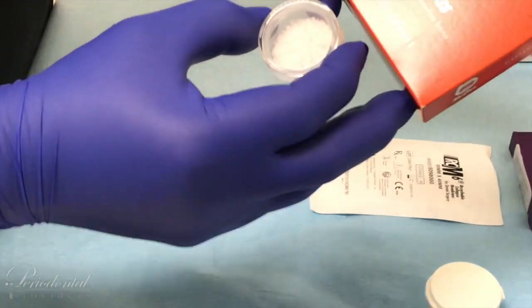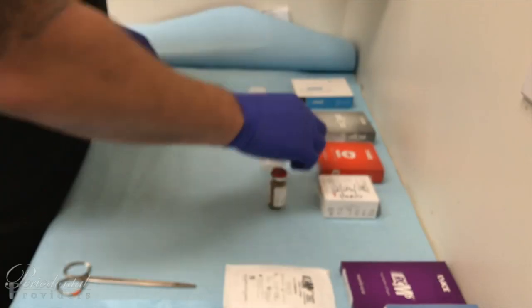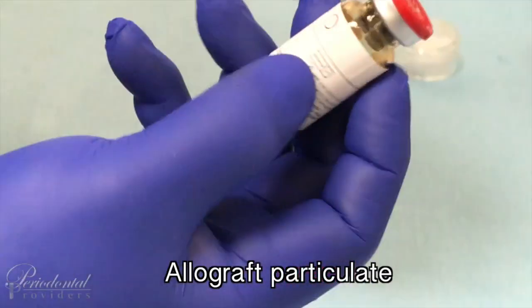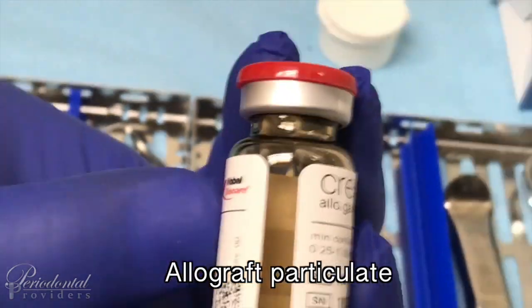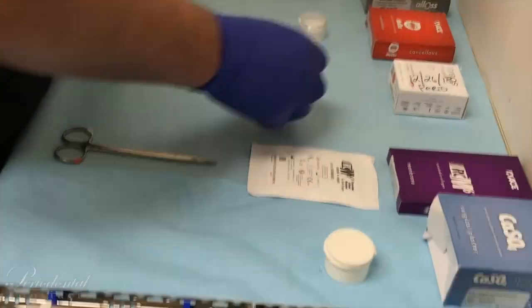Then we move on to the cancellous, which is your bovine bone. As you can see, the particle is a little bit larger. We also have our Nobel BioCare Creos bone grafting material — it's a mineralized cortical. The grains are a little bit different in texture, and usage also depends on the procedure being performed.